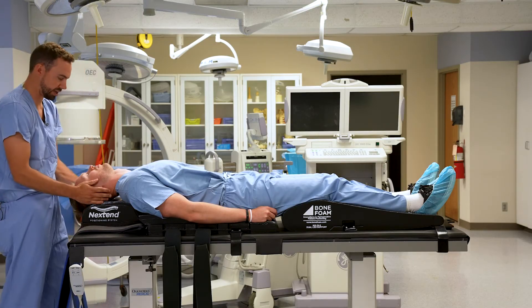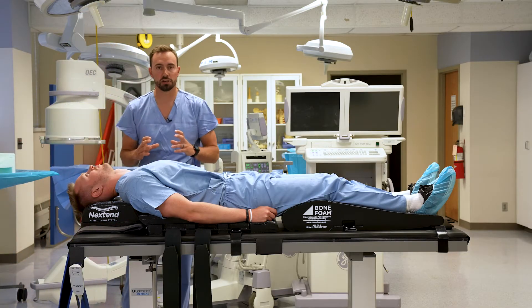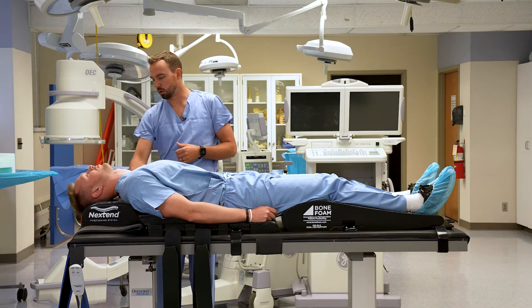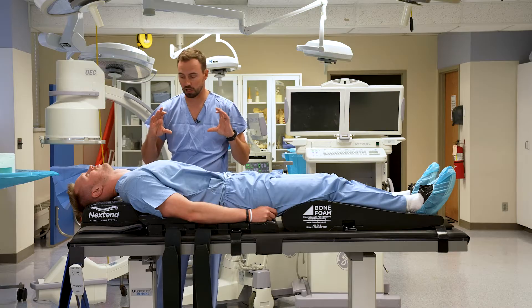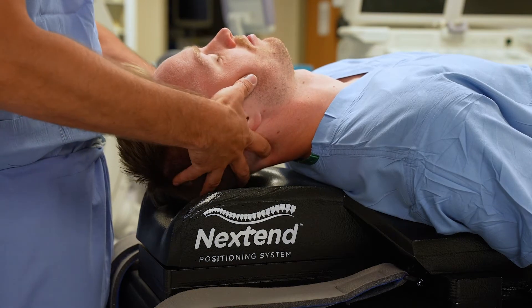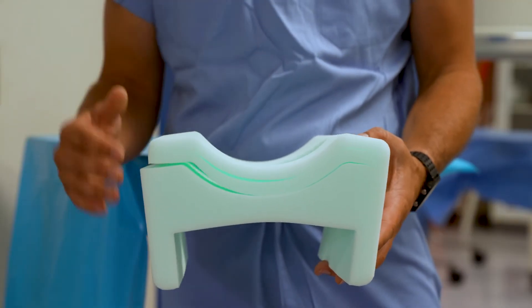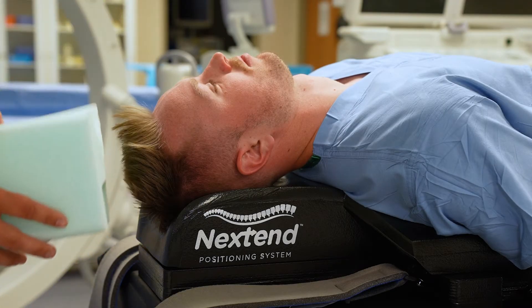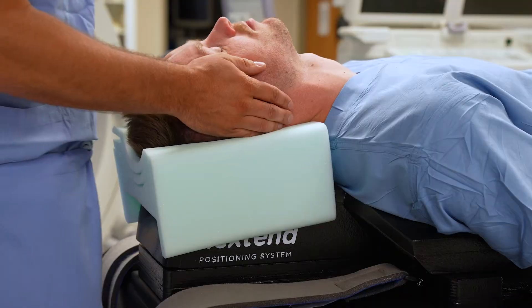I like where Dawson's head is at. The Next End positioner is designed to give a little bit of cervical extension of the neck, which really helps optimize the surgical site anteriorly. If the head is on this piece by itself, this is as much cervical extension as you'll ever need. Sometimes surgeons want the head in a more cervical-neutral position and then just tilt the head back. In that case, we offer a single-use head portion with adjustable heights. With that in place, Dawson is at a more cervical-neutral position, and we can tilt his head back to optimize the anterior cervical portion of his neck.